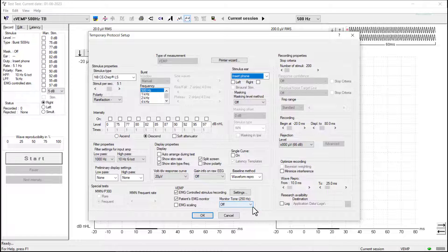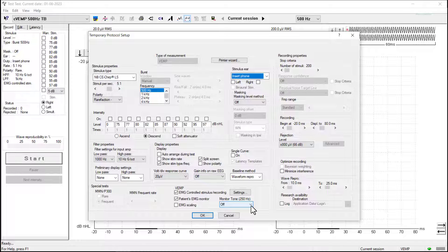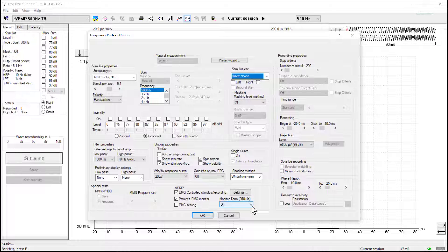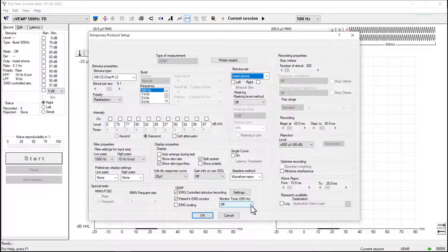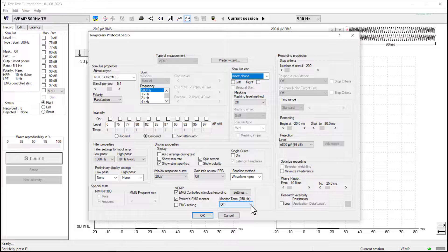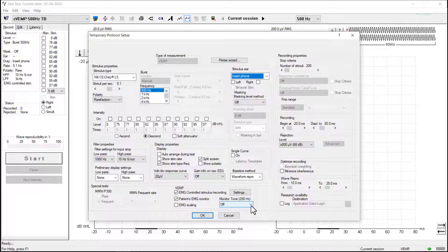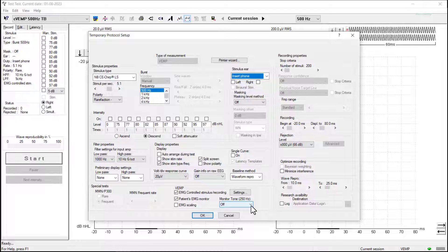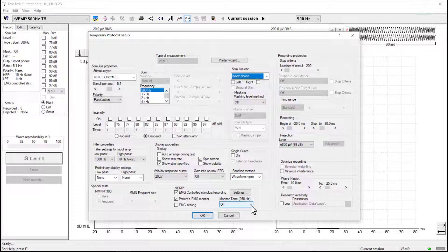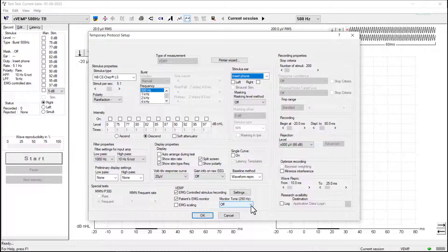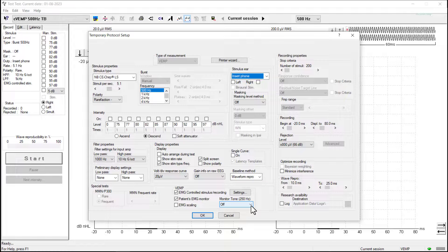On the right hand side here we also have a monitor tone. This is a sound that is delivered for the patient to listen to in the same way as the EMG monitor bar but this provides an auditory indication as to whether they are providing sufficient muscle contraction.